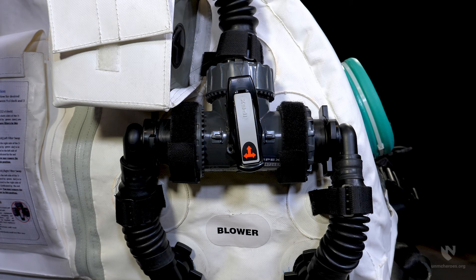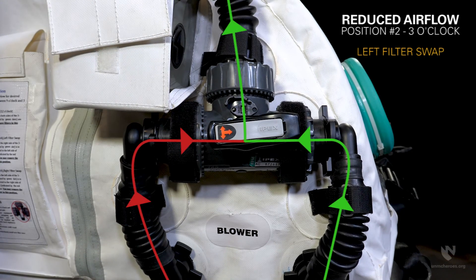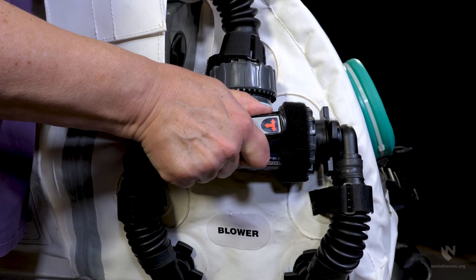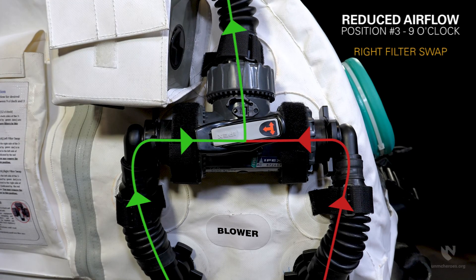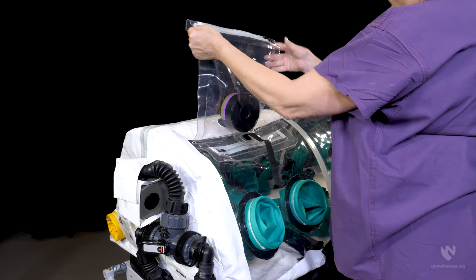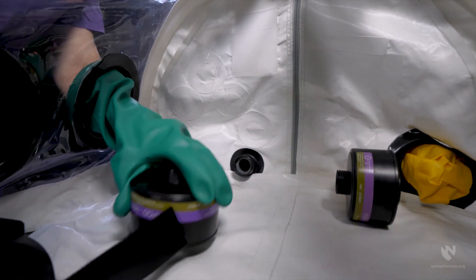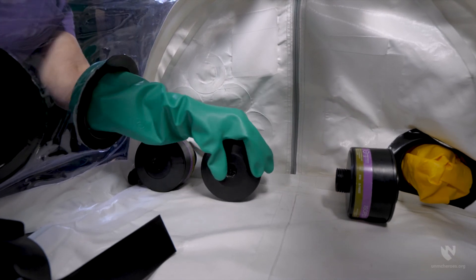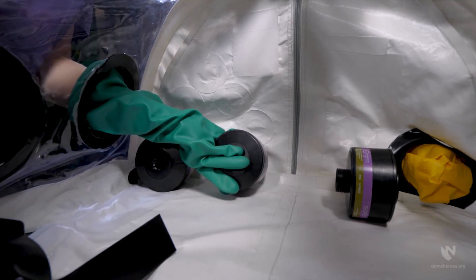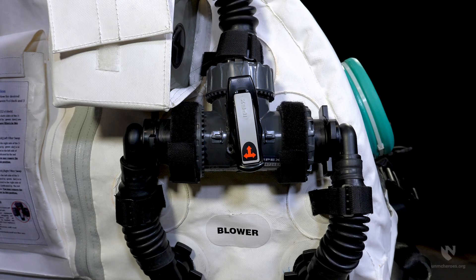Turn the valve to the desired position to isolate the filter to be changed: position two at three o'clock for a left filter swap, or position three at nine o'clock for a right filter swap. Open the new filter and introduce it into the enclosure using the vertical drop bag as previously described. Remove the old filter using the closest glove port and replace with the new filter. Manage the old filter as waste per your organization's policy and protocol. Be aware that contaminant may be in the breathing hose after the filter is swapped and the three-way valve is returned to its original twelve o'clock position to operate from both filters.